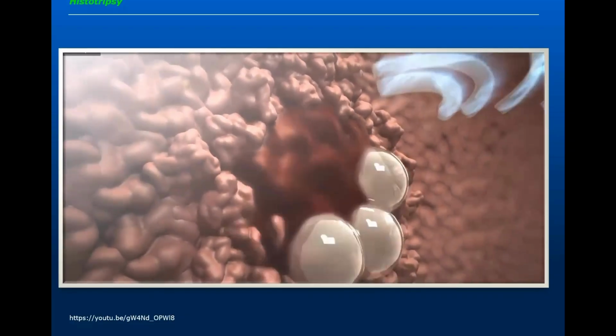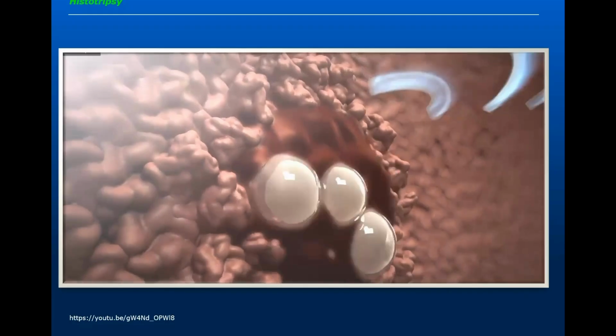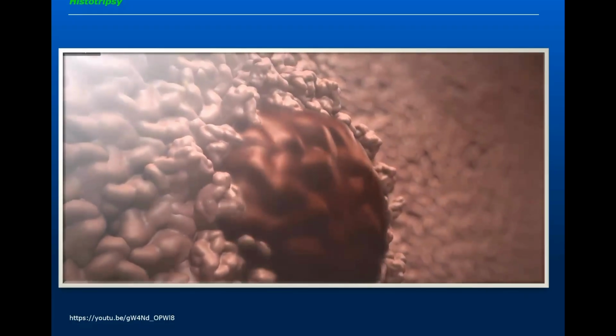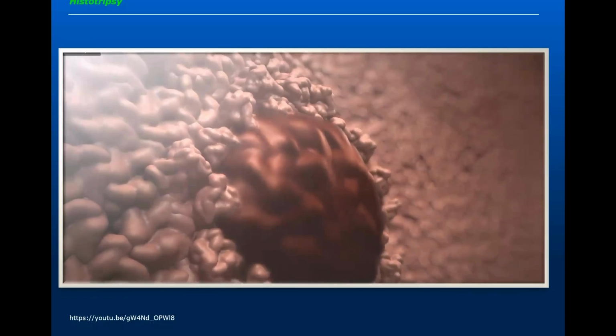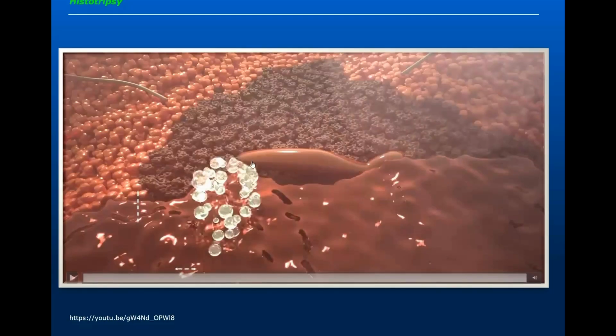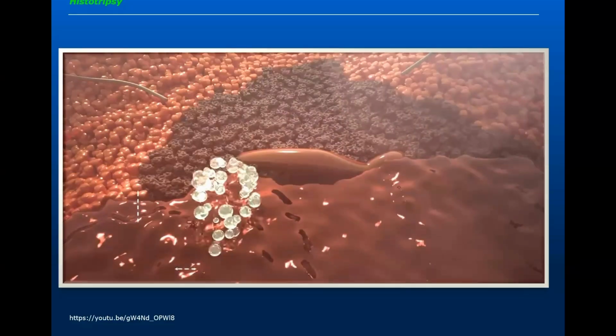The nice thing about it is there is a very sharp demarcation between the dead tissue and the untreated tissue. This is very important. Gives you a very clear margin. And also, as you see here, the blood vessel is intact. This means that if this tumor is encasing the IVC, you can treat it with histotripsy. You need to think a lot if you are using a microwave or radiofrequency ablation.